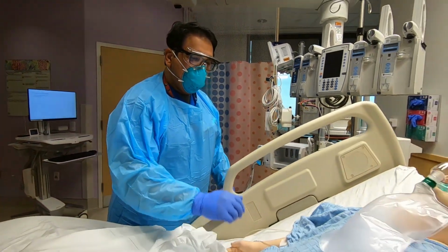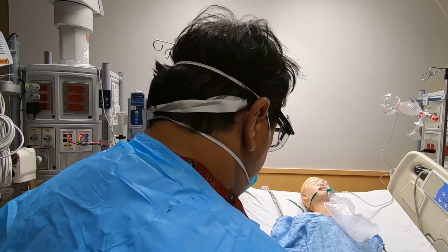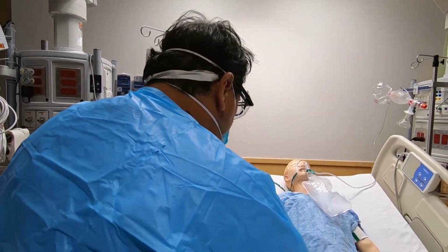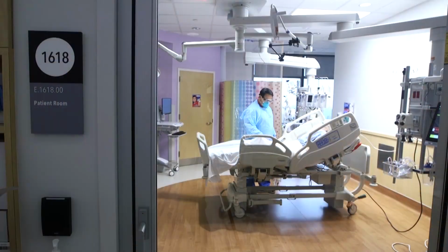Our bedside nurse is assessing the patient in full PPE. Our patient has already been determined to be in need of intubation, and the team is assembling outside of the room.